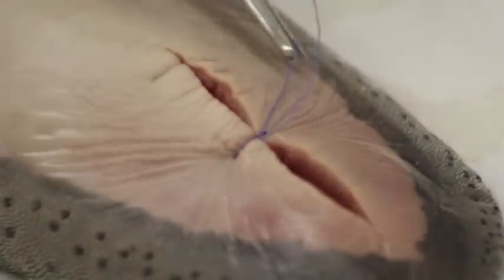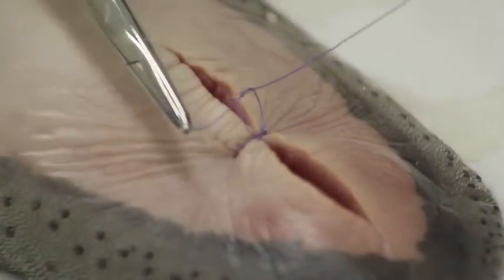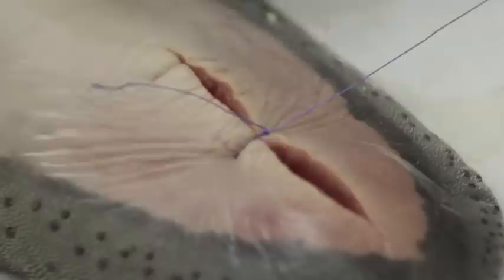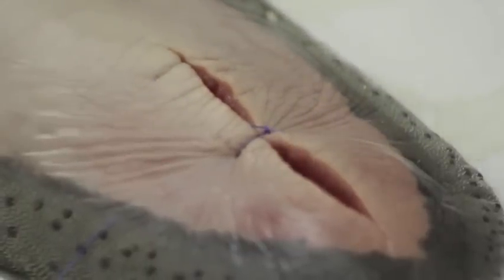Do it one more time — wrap once, grab the tip, always grab the tip, and pull evenly on both sides so it comes down flat. Now we cut, and we have our first interrupted stitch.